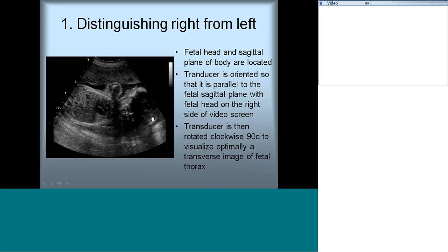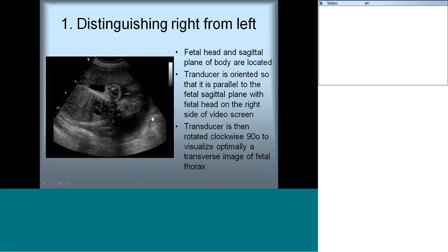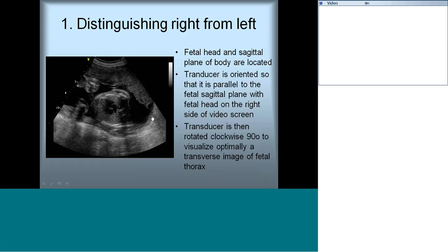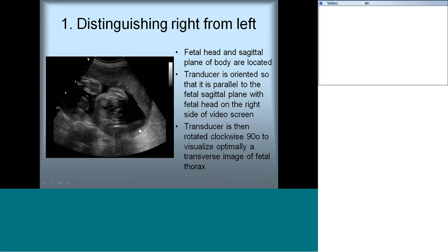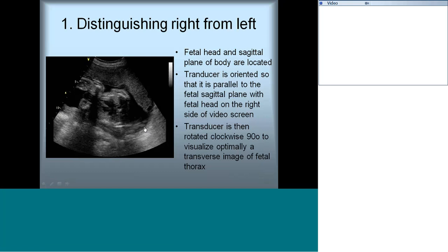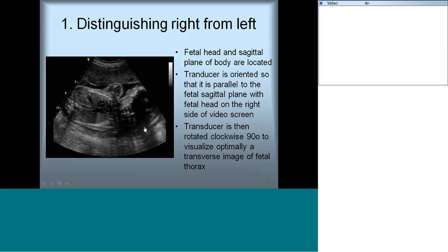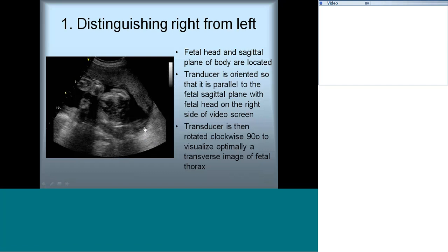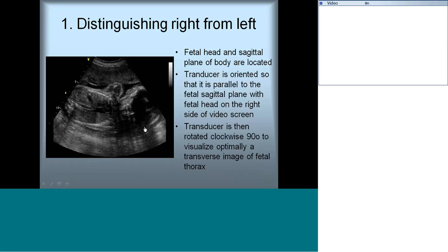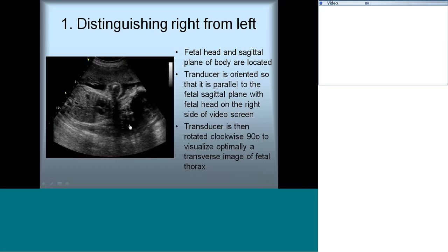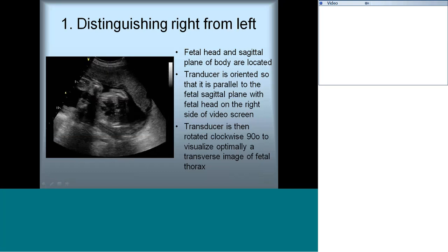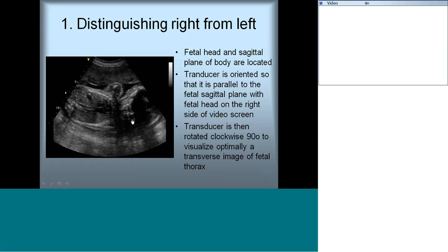In case the fetal head is on the left, you can use the right-left inverse button. Once you get the fetal head on the right side of the video screen, rotate the transducer clockwise 90 degrees so that we get a transverse image of the fetal thorax — a cross section of the fetal thorax.